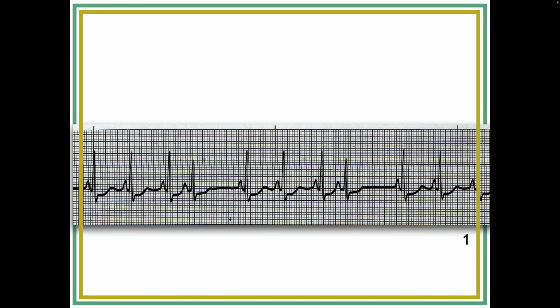Grace, if you could just scan across here and point, I will tell you there are 2 premature beats here. Where are they? I think you can see it without your calipers. Yeah, there you go. Good. And there's the other.